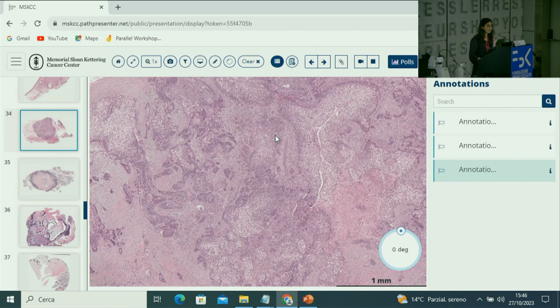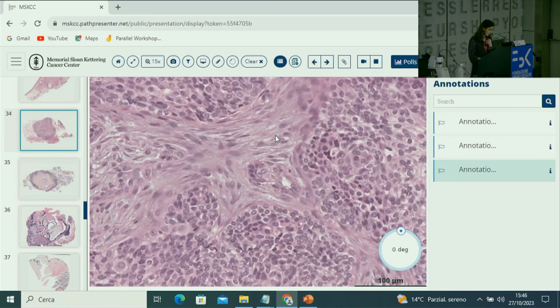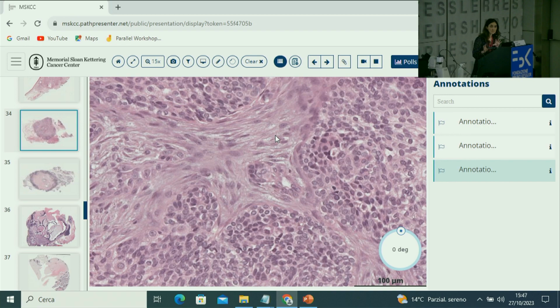If you are in the minor salivary gland, the presence of dysplasia or in situ carcinoma favors the diagnosis of squamous cell carcinoma and adenosquamous. And also what I find quite helpful is that even in a high-grade mucoep, notice there is no significant ugly cytology or pleomorphism. They do have this monotony, as do all these salivary tumors, or tumors in general with a translocation. So that's also a hint that it's maybe not squamous cell carcinoma. Often you don't see keratinization in a mucoep.